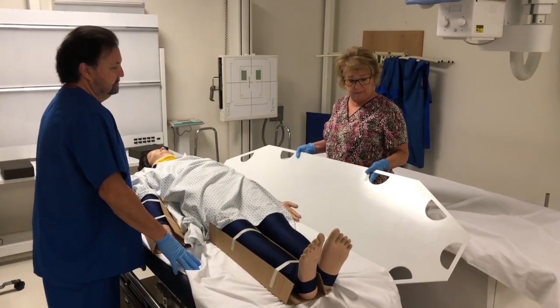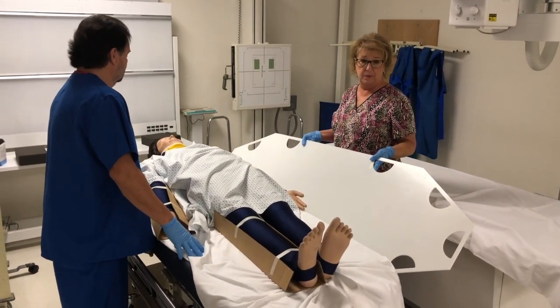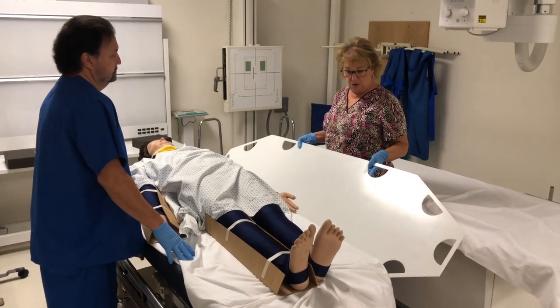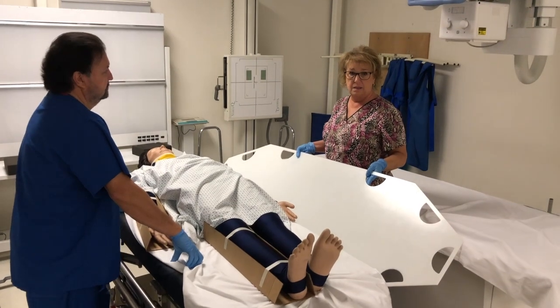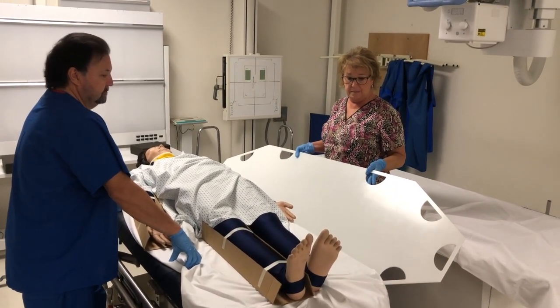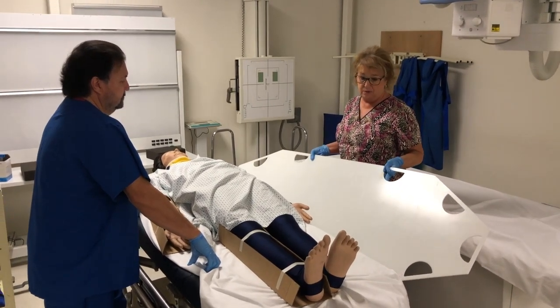So most of you have probably seen or used a slider board or a slick board. It's not stiff enough to hold body weight to pick up and move, but it does make a nice mechanism for sliding from the gurney to the x-ray tabletop.